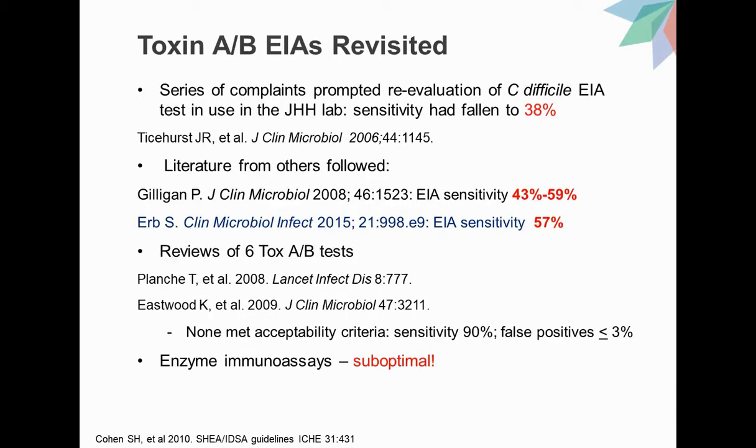C. diff ×3. I arrived at Hopkins in 2002, and shortly thereafter, I began to get a series of complaints that prompted us to reevaluate the C. difficile EIA test in use in the lab at that time, and much to our dismay, we found that the sensitivity of that assay had fallen to 38%. And therefore, we switched to the cell culture cytotoxicity neutralization assay. Literature from others followed, which duplicated our results.